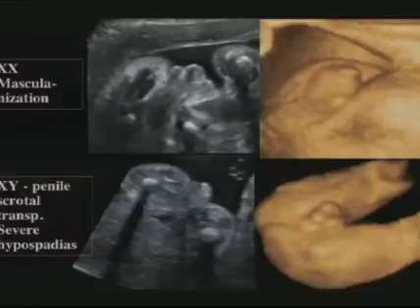Now look at how incredibly different they look in 3D, but how similar they look in 2D. And this has been very helpful because then we can ask our colleagues in urology to help us make these diagnoses, because now we can render them in a way that they're used to looking at them.